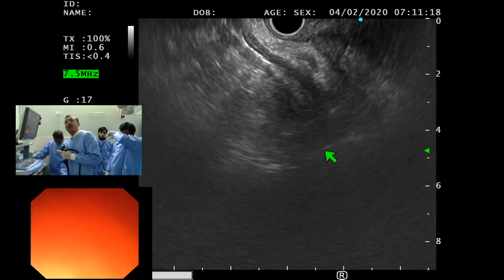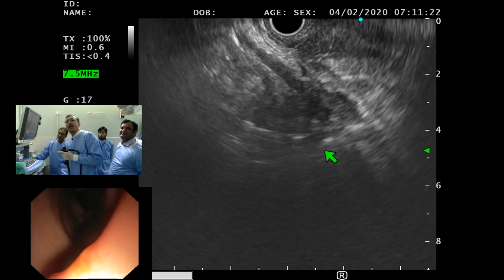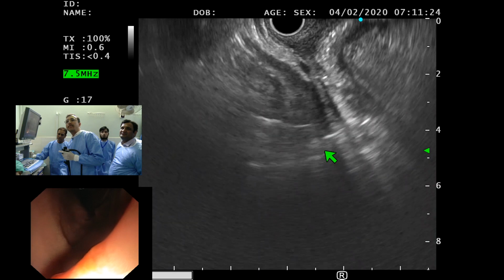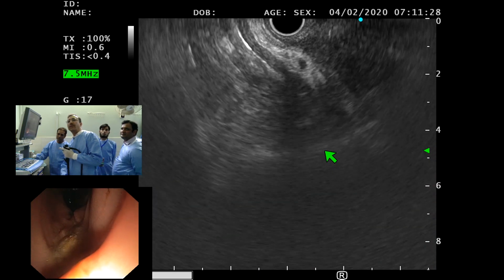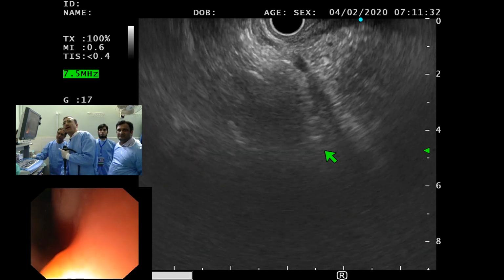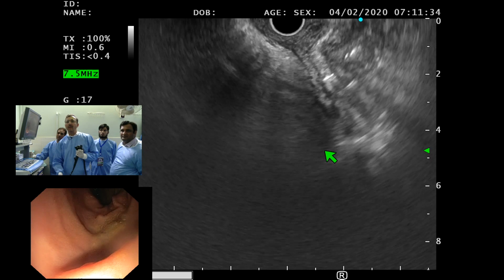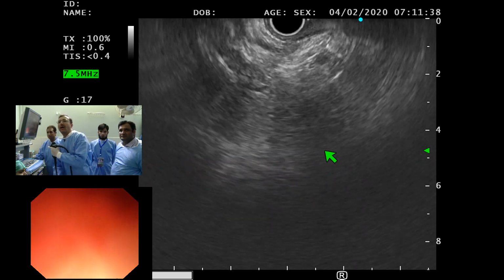We were seeing the pancreas very nicely from one area within the bulb, right? Yeah, that's right. But now that doesn't seem to be. I'm trying to concentrate on the lower end of the CBD. What I'm saying is that we can go back. The pancreatic duct should be there as well, because the pancreatic duct was fairly prominent, so maybe.